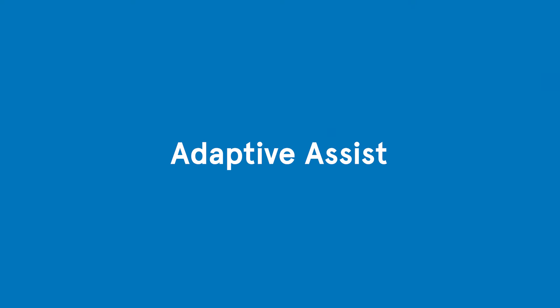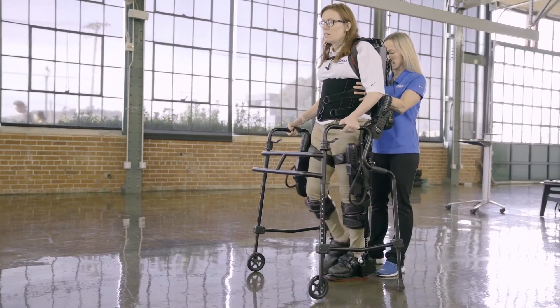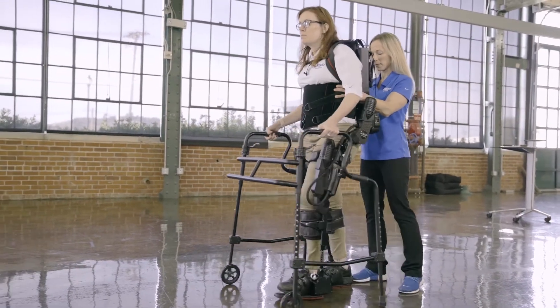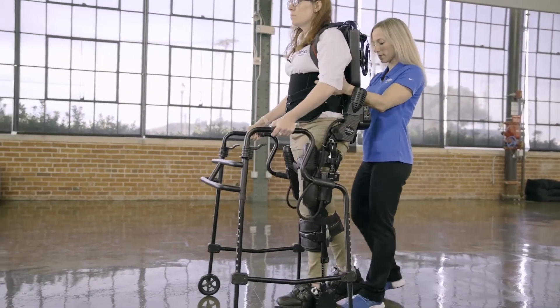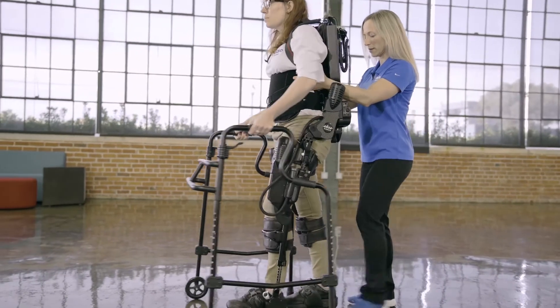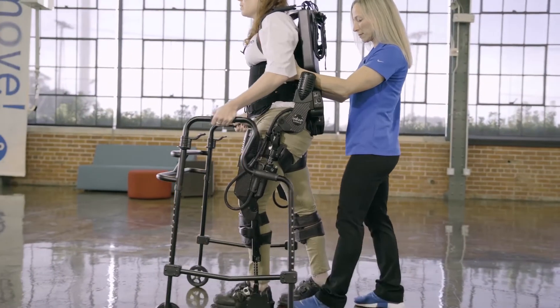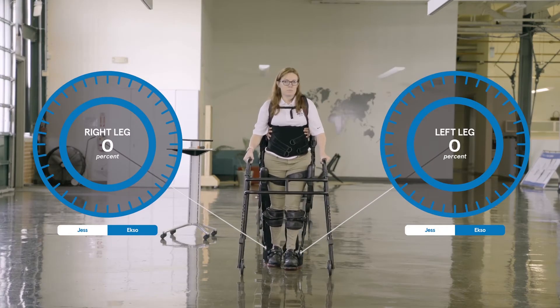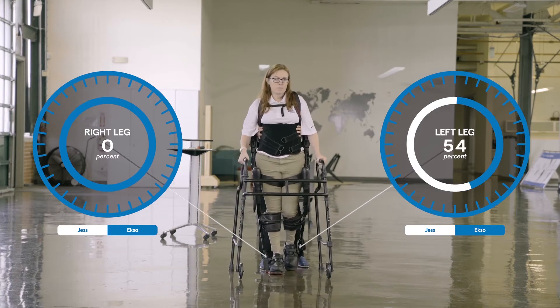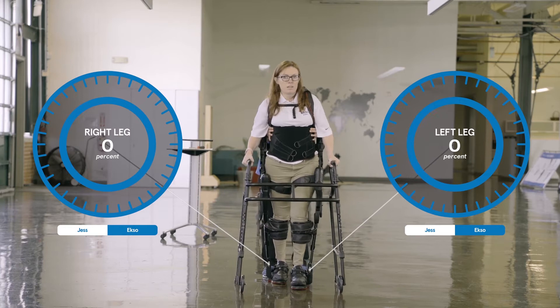Generally, bilateral adaptive assist is a starting point with most patients. This mode allows the patient to feel the gait path or trajectory that Ekso is trying to keep them on. It also forces the patient into a symmetrical gait pattern and allows them to take smooth, repetitive steps. EksoNR will adjust the amount of assistance it provides as needed — assisting less if it senses the patient doing more, and assisting more if the patient is doing less, to create smooth, natural steps.